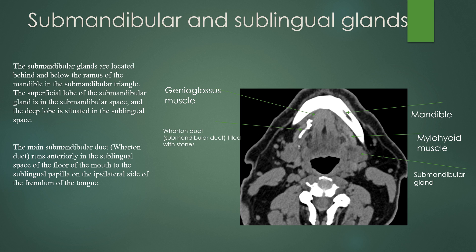The submandibular glands are located behind and below the ramus of the mandible in the submandibular triangle. The superficial lobe is in the submandibular space, but the deep lobe is considered to be within the sublingual space. The main submandibular duct, aka Wharton's duct, runs anteriorly in the sublingual space in the floor of mouth to the sublingual papilla on the ipsilateral side of the frenulum of the tongue. Here are stones filling Wharton's duct, outlining it well. This is the genioglossus muscle, the mylohyoid muscle, and the mandible where the muscles attach anterior to where Wharton's duct will come out.